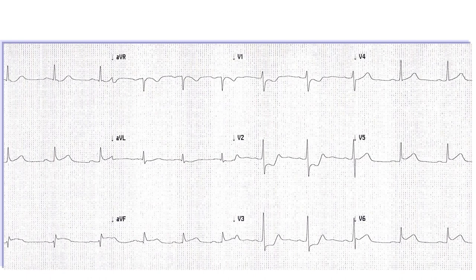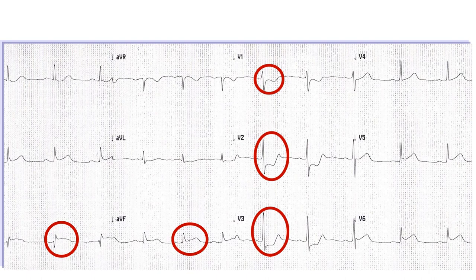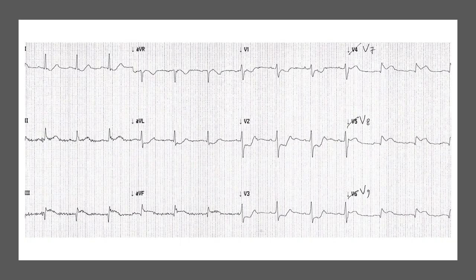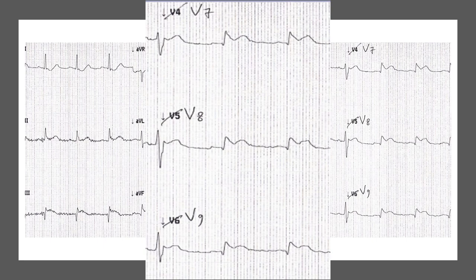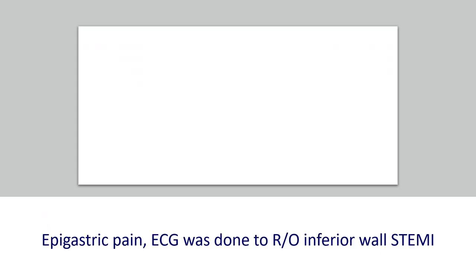Here is the example we just discussed: inferior lead ST elevation with tall R waves, ST depression, and upright T waves in V1 to V3. Because I suspected posterior wall STEMI, I did posterior leads. Making them bigger, you can clearly see ST elevation in V7, V8, and V9.